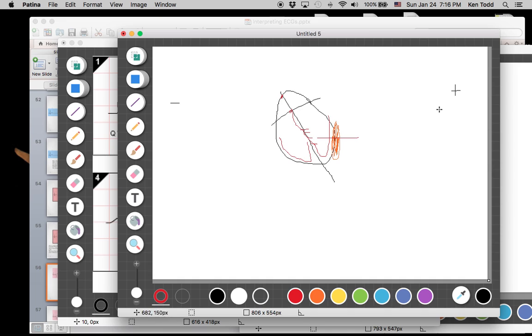But that'll be transmitted through. So I may see a little bit of an elevation in this. Now if I'm looking at it through a different lead, that can give me a downward deflection when it first starts. And that's where I will get that pathological Q wave. So it varies depending on where it is in the heart and which lead you're looking through it at.